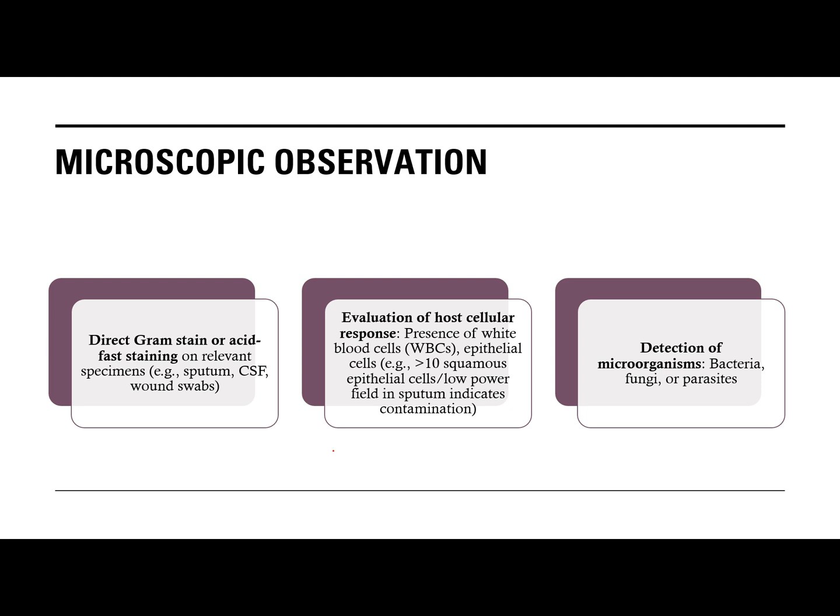If your sputum sample or your respiratory sample has more squamous epithelial cells, most likely salivary yan. It has to have more WBCs to be considered sputum. So, yan ang isa sa mga ginagamit nilang criteria. Then you need to check for organism. Are there bacteria, fungi, or parasites?